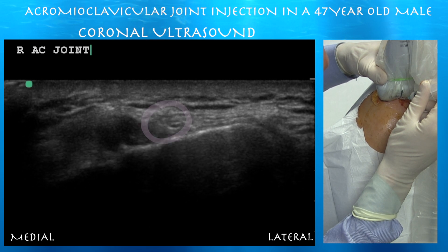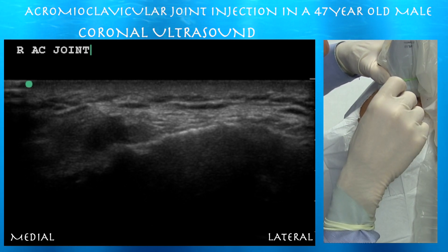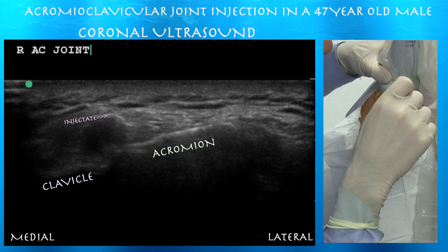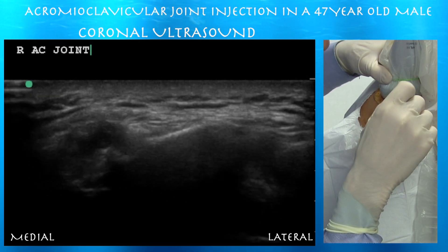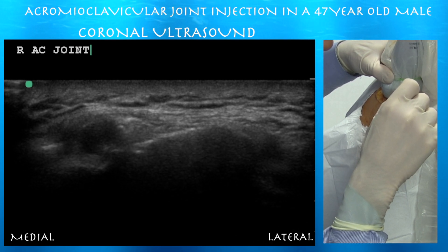We're a little bit lateral initially, so we have to redirect our needle and go more medial to get just under the capsule of the AC joint. Now you can see that tip in the joint. You can see that the injectate is within that space underneath the capsule above the articulation of the acromion and the clavicle. You can see those bright dots, which are essentially the injection, and that should be seeping into the acromioclavicular articulation.